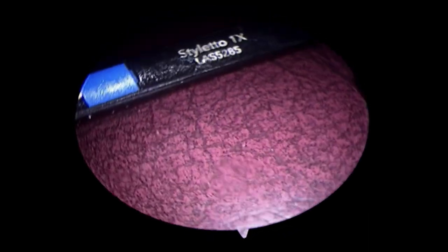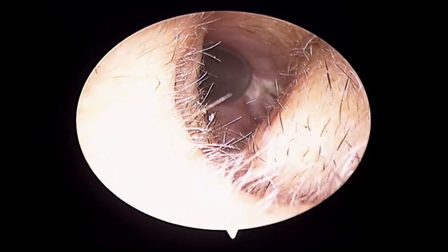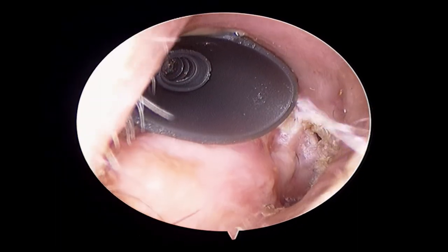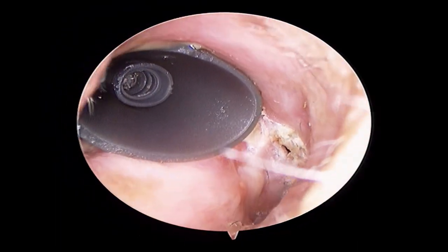In this video you can see a soft part known as the dome of the hearing aid, which is conical in shape and usually goes inside the ear to deliver the sound. This part sometimes gets stuck in the ear, especially in the operated ear having a mastoid cavity, as you can see in this video.